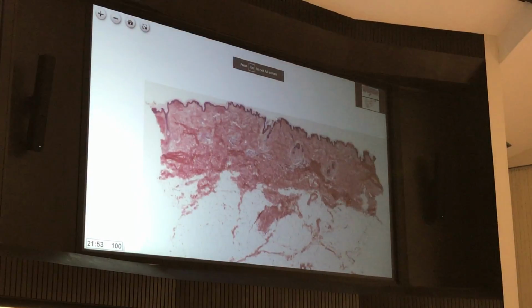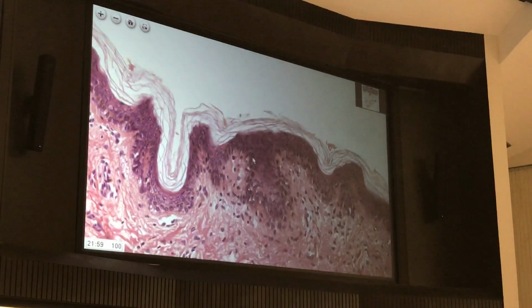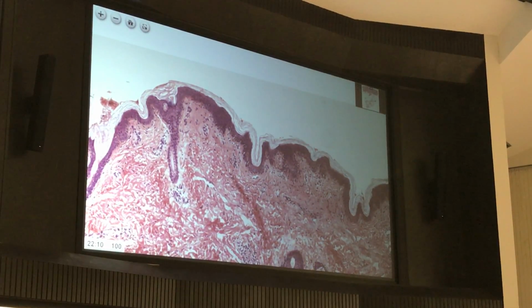Compare what we just saw to this one. Stratified squamous down here, and look at this material. That's your keratinized layer. And you can see usually the keratinized layer follows the contour of the epithelium, whereas the other just sloughs off randomly. But you can see it's a very regular process of making this fibrous. And we only see keratinized epithelium on our skin, in our lips, in the inner regions of our mouth a little bit, inner regions of our nasal cavity.